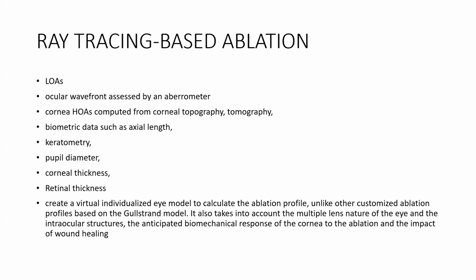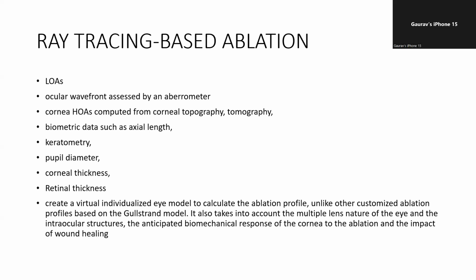That is one of the customizations which is possible on the FCAT, sir. So try to find this out in the next LASIK session: how we feed the original Q value, like the existing Q value of the eye, how we calculate the intended Q value, and how we can change it and play with it. Okay? Okay sir. Let's go ahead.